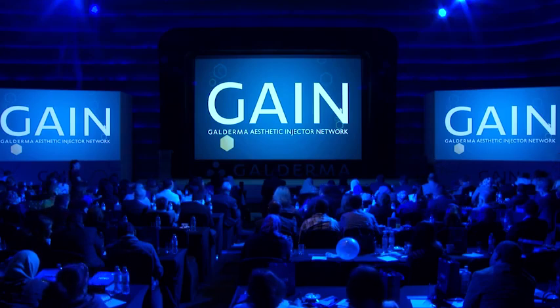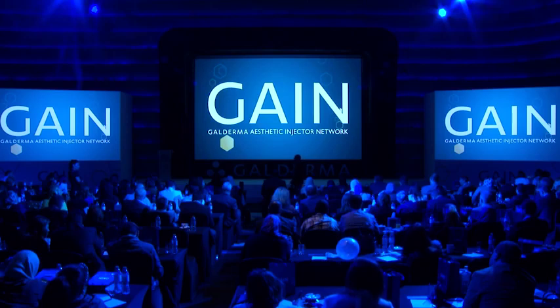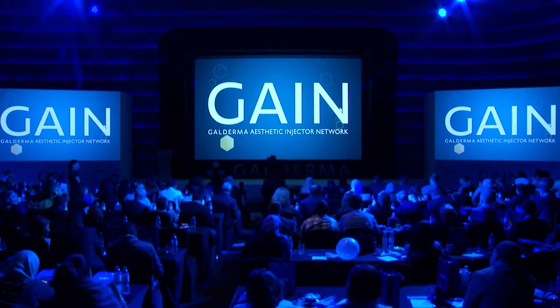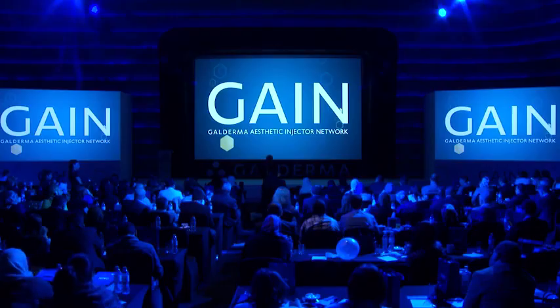If you want to use Finesse for this indication and you have that hollow that you are commenting on, it's also nice if you need a little bit more HA in that area. Finesse is a soft product with particle size 1 and cross-linking 1, still very soft, and it could also be a good option for those cases. But I agree, if you use something very thick, you can have an obstruction of the lymphatic drainage.